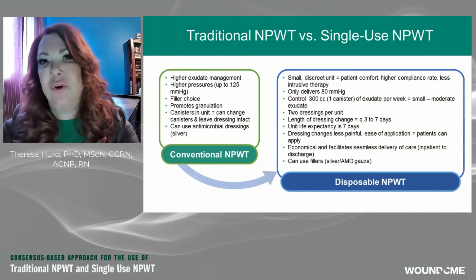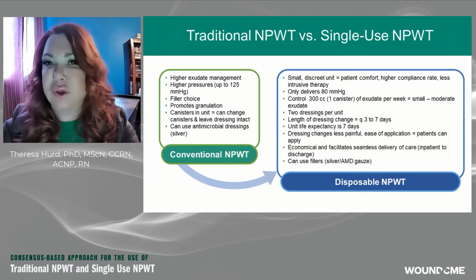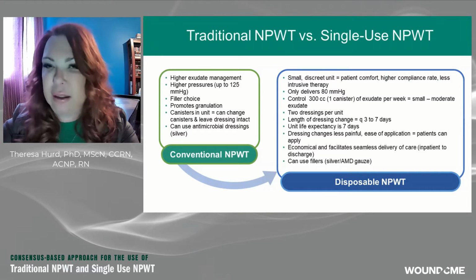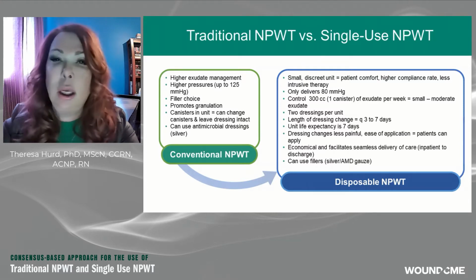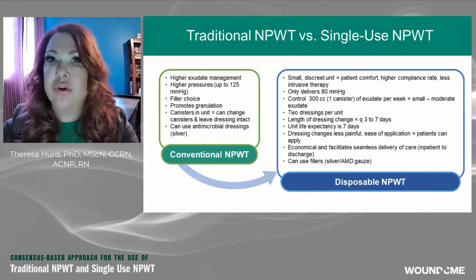I took care of a great deal of patients in my clinic that had what we call pilonidal sinus. And we used to like to put negative pressure on them. And I particularly had a surgeon who would do surgery and wanted to put negative pressure, because we found when we did that, our healing times were decreased significantly. These are usually on very young patients. So often they'd be in university, they'd be in school, and they did not want to walk around with a large machine going back and forth to school.